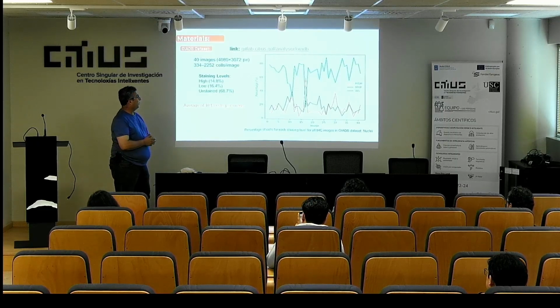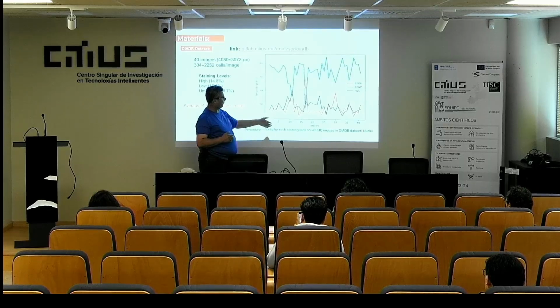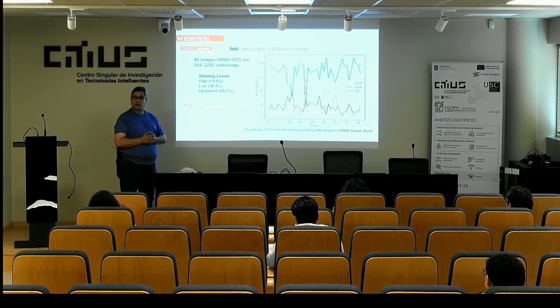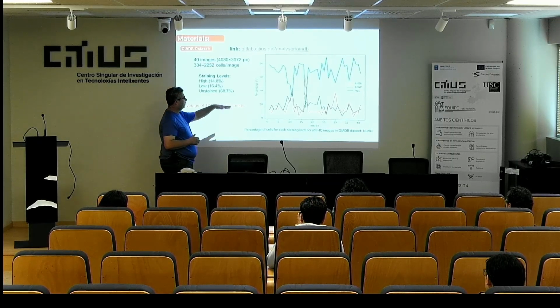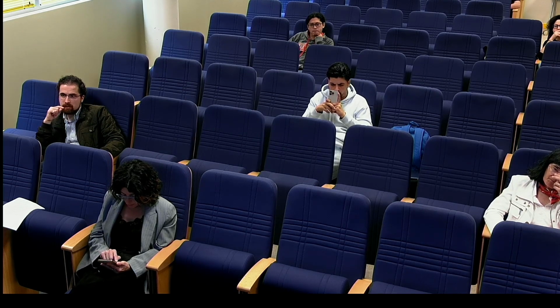We show here the diagram that shows the variety of the level of staining for the average of all images, and each image has its own variety. Now we will present some of these immunohistochemical images to show you what the problem is and how we can detect.